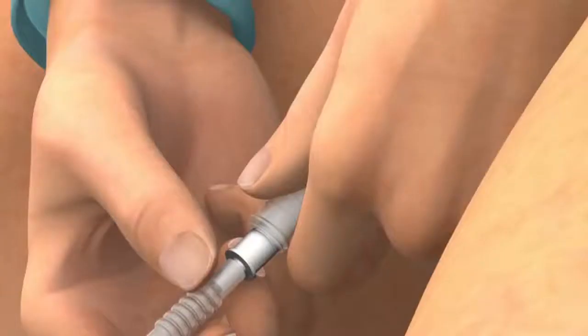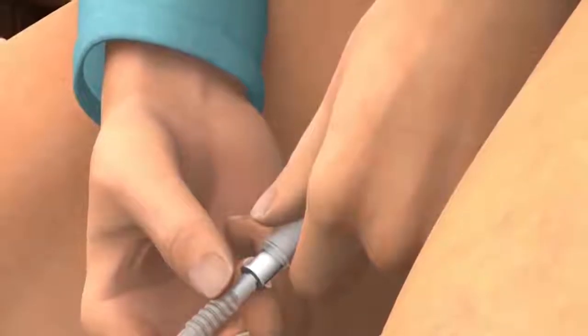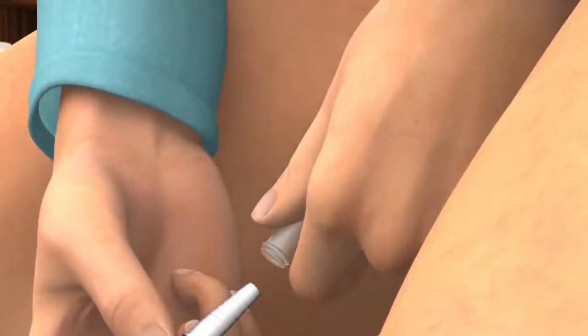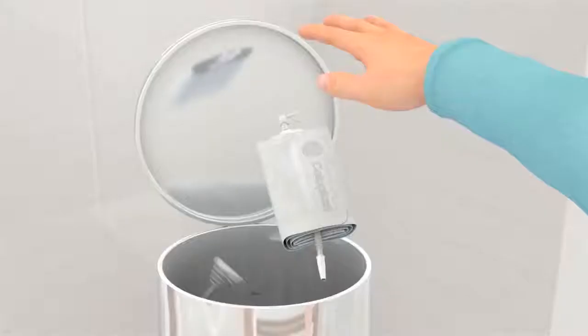You need to change the Urosheath every day. The interval between each change should not exceed 24 hours to ensure good hygiene and minimise the risk of urinary tract infections. Detach the Urosheath from the urine bag connector. Carefully roll the Urosheath off the penis. Warm water can be used to help soften the adhesive and release the sheath if necessary. The Urosheath and packaging can be disposed of in your household rubbish. Do not flush it down the toilet.